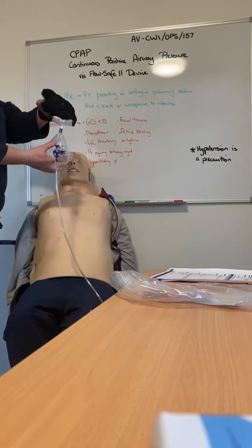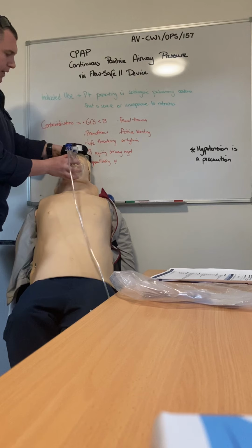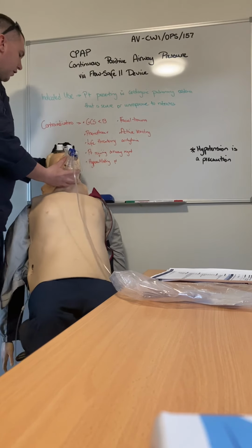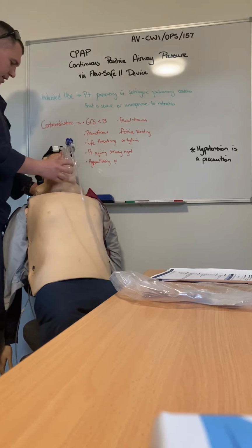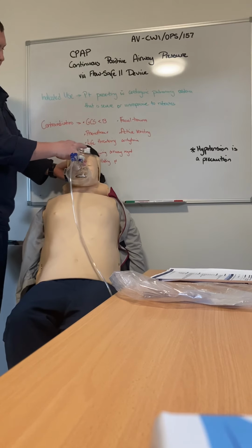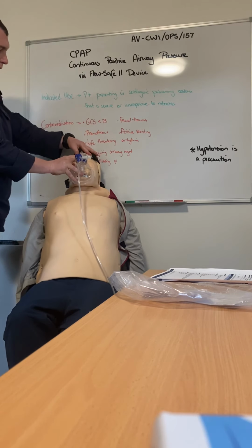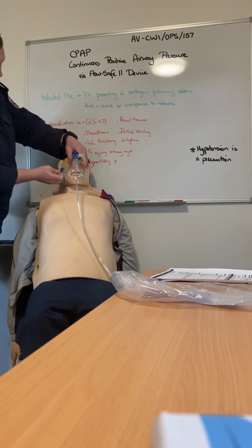And then you are to apply it to the face and put the headrest over the top, making sure that the top of it, the bridge, goes over the nose and goes all the way around the mouth. This goes all the way over the head. We have 2 little forehead blocks at the top. I'm not sure you can see it very clearly, but there are 2 white blocks here. So we make sure that this is attached to, or pressing against, the forehead. And then we have 2 blue clips that we click into the side.